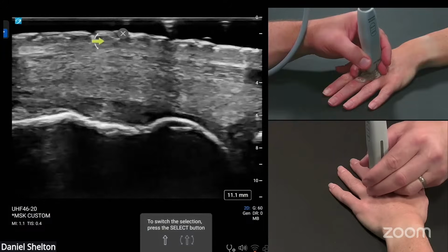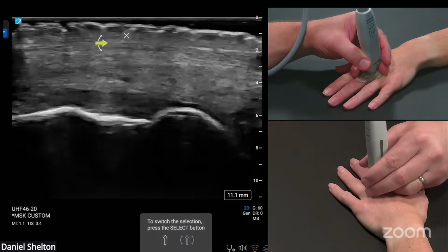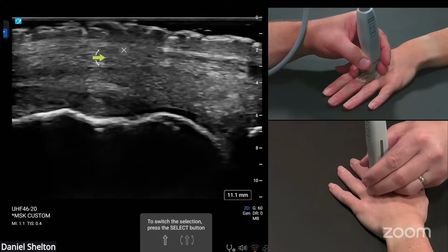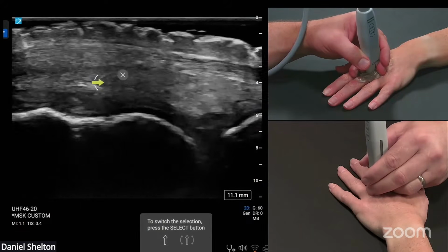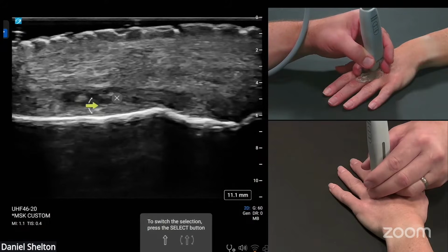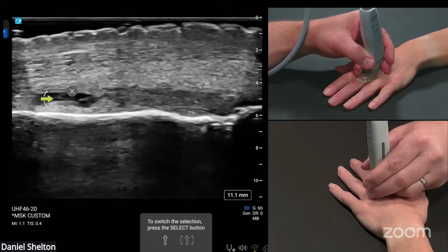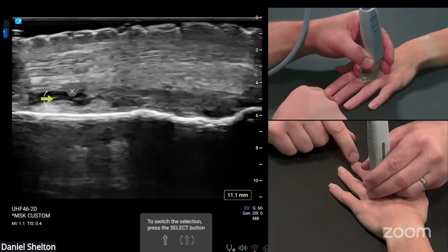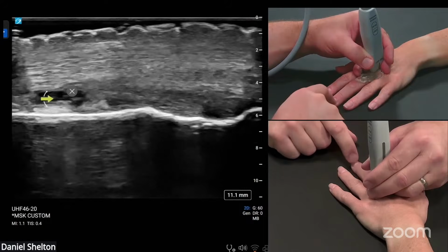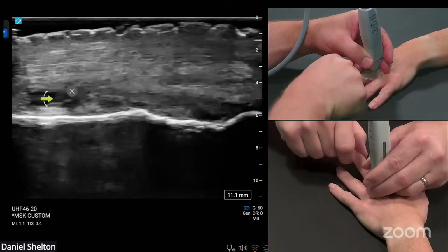little bit. So let's trace that distally now that we've kind of vetted out our superficial and deep sagittal bands, our metacarpal notch and joint capsule, which is redundantly folding back here at 46 megahertz. We can see a normal joint recess on an MCP joint, which is not always the case with lower frequencies. It will be averaged out. So there we can see I'm just causing that joint capsule to move.